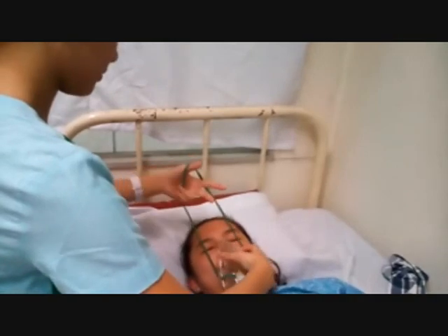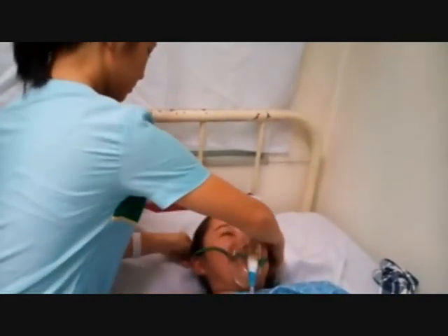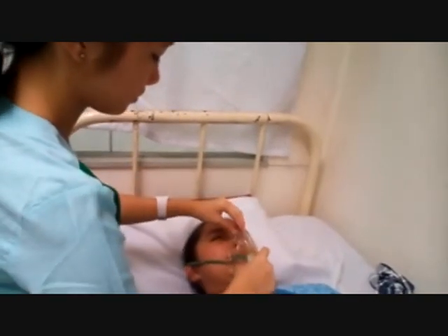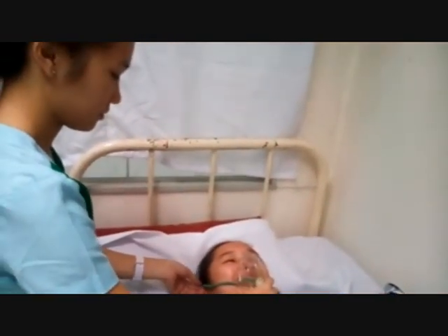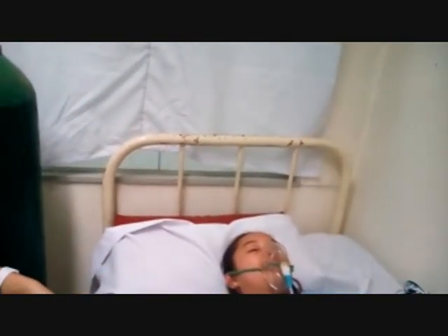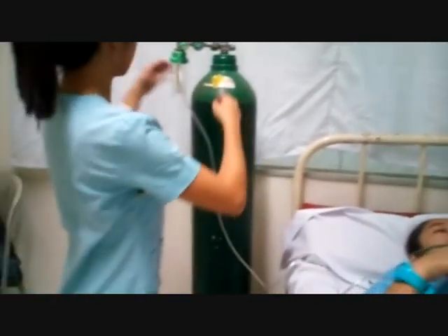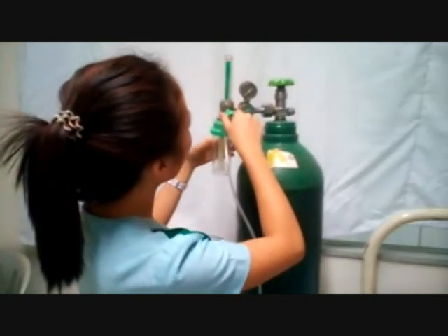Position face mask over patient's nose and mouth. Adjust the elastic strap so that the mask fits snugly but comfortably on the face. Adjust the flow rate to the prescribed rate.